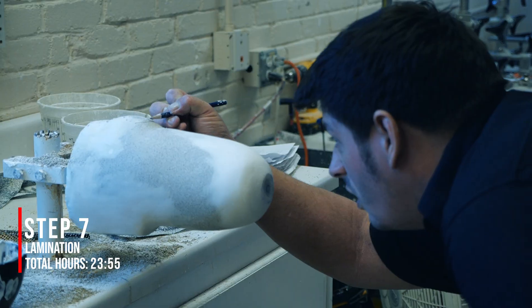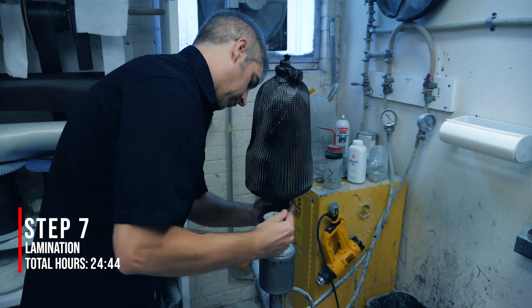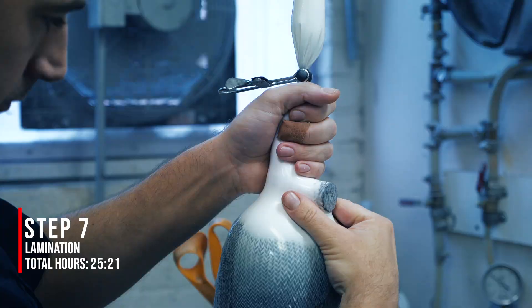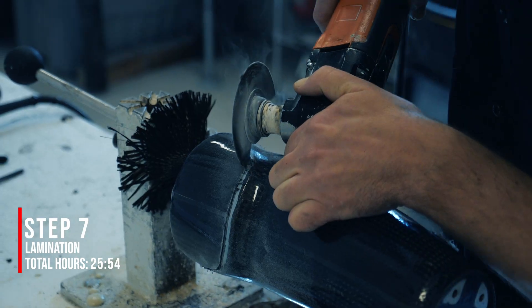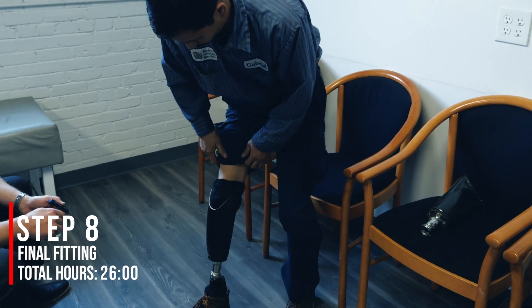Another plaster model is created from the check socket. Multiple layers of composite materials are layered over it. The model is sealed and impregnated with resin and given time to cure. Then the socket is finalized by cutting, drilling, breaking, trimming, grinding, smoothing, assembling, and aligning. Another patient visit and the socket is complete.